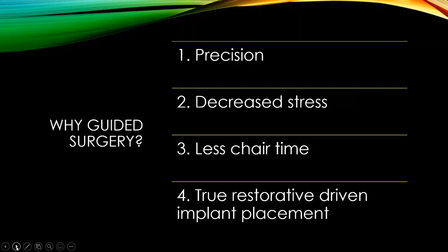So big question, well, why guided surgery? Precision, decreased stress, less chair time, and it's a true restorative driven implant placement. These are all some of the many reasons as to why you would choose to do guided surgery.